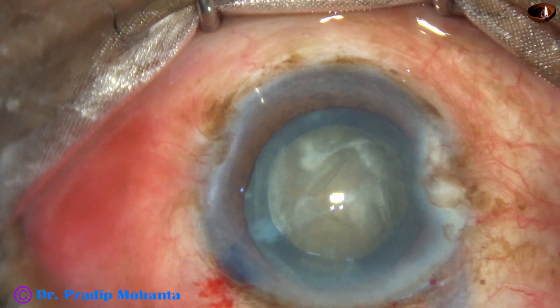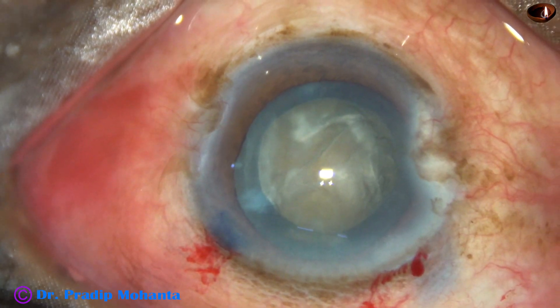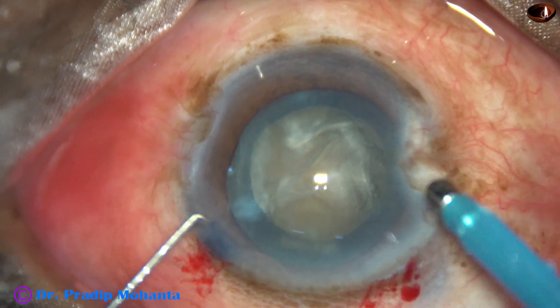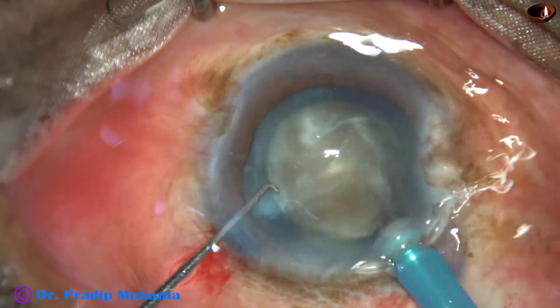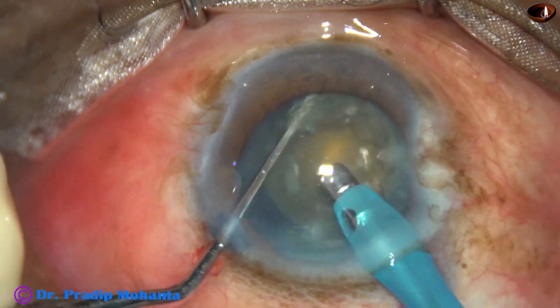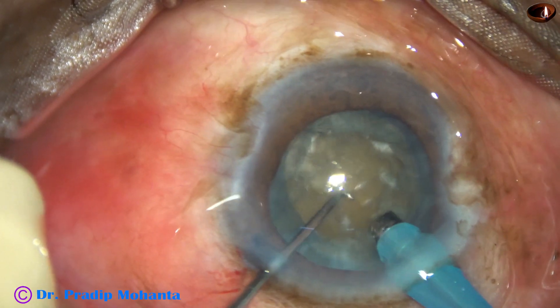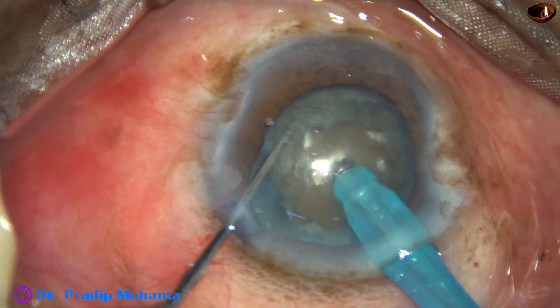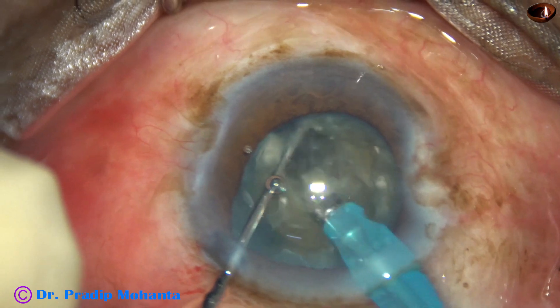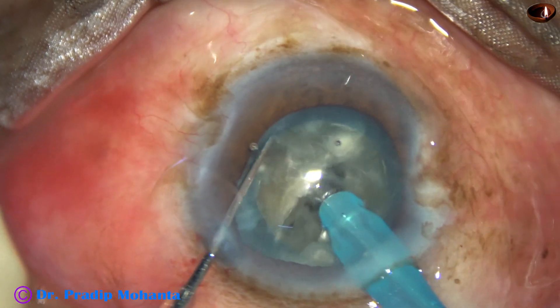Some more Visco, and now is the time to go into the eye. The machine being used is Oertly Catarix 3. The phacoemulsification tip goes in with its bevel down. Some superficial cortical lens matter is removed, and now the tip is buried into the substance of the nucleus. It goes through the nucleus towards the opposite equator, and I get a very nice crack. Rotate it 180 degrees.